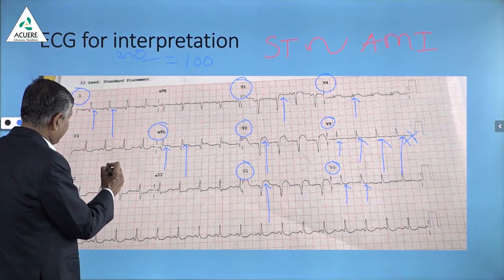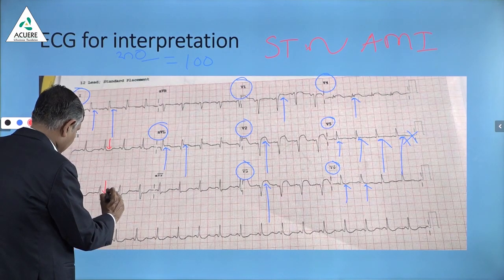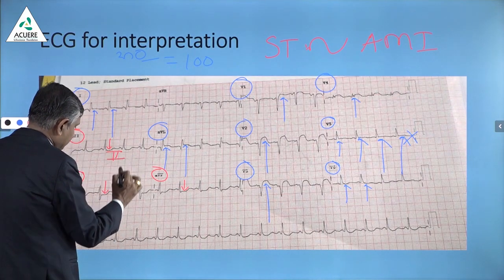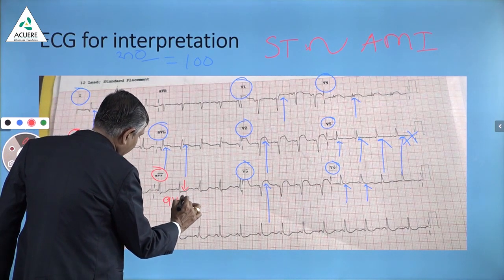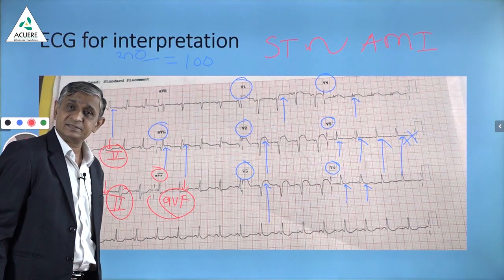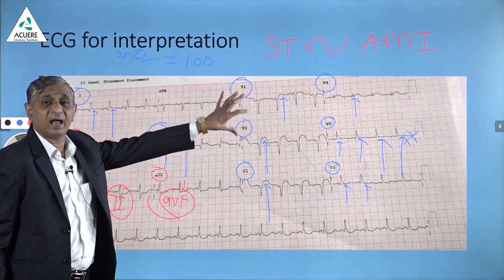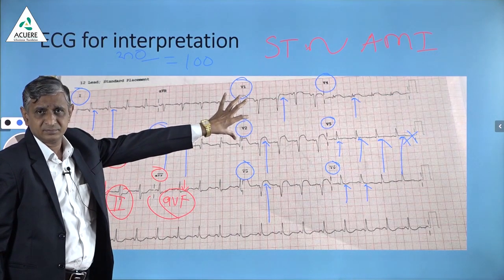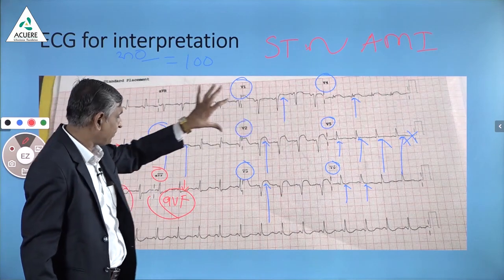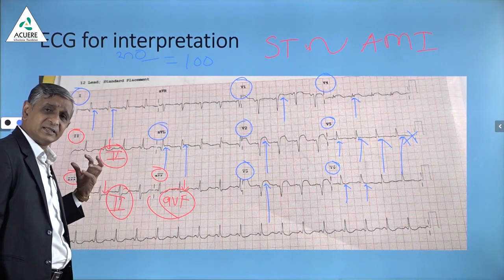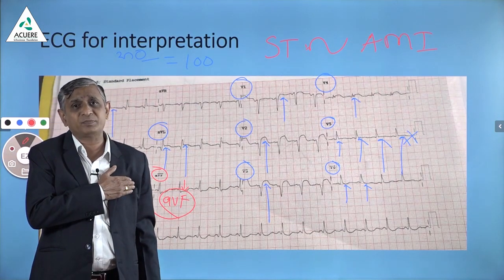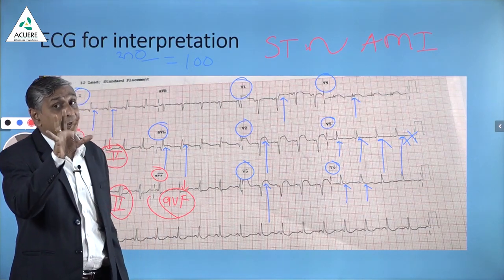In this ECG, ST depression is seen in lead 2, lead 3, and AVF — these are the inferior leads. So in the anterior leads and the upper lateral leads you are getting ST elevation, and in the inferior leads you are getting ST depression. This ST elevation accompanied by ST depression confirms this ECG as acute myocardial infarction covering the anterior and upper lateral portion of the heart. This may be an evolving ECG.